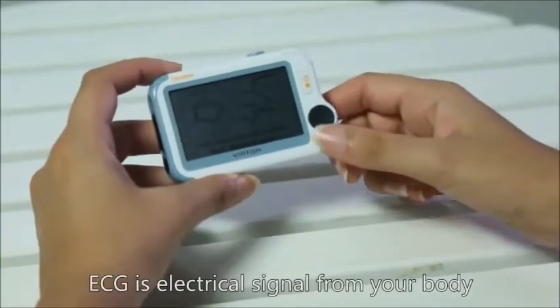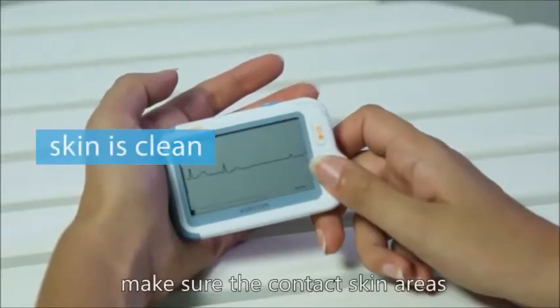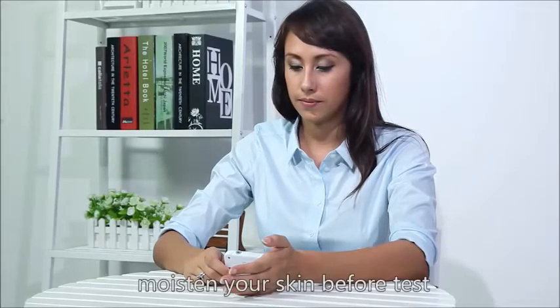Essentially, ECG is an electrical signal from your body. Before measuring, make sure that the contact skin areas are clean and not dry. If your skin is dry, moisten your skin before testing.